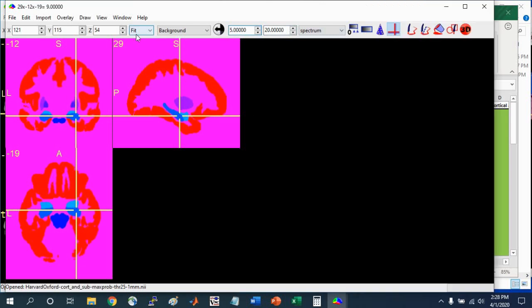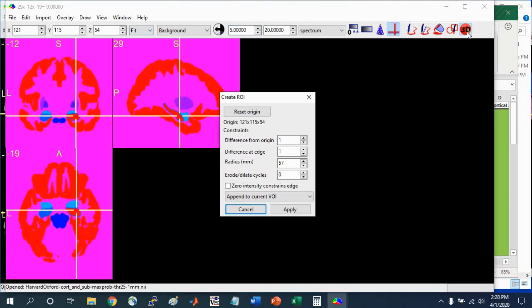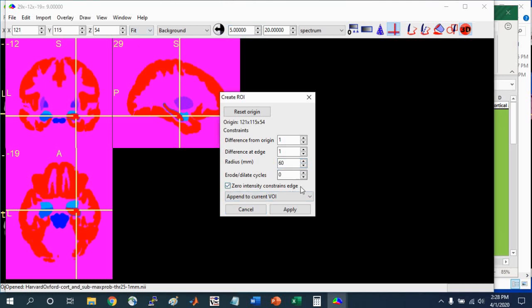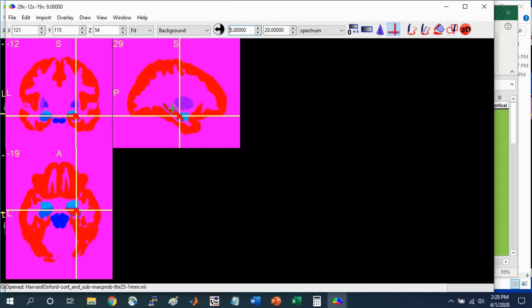While we're here, I can show you quickly how to draw a volume of interest, also called a region of interest, that encompasses, in this case, the right hippocampus. You can use the 3D bubble tool. I'm just going to left click on it and keep the difference from origin to 1, difference from edge to 1. Make sure the radius of this bubble is larger than the hippocampus itself. You can click the zero intensity constrains the edge and click apply.